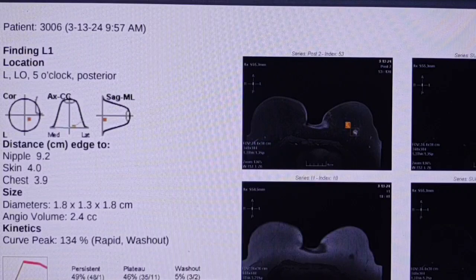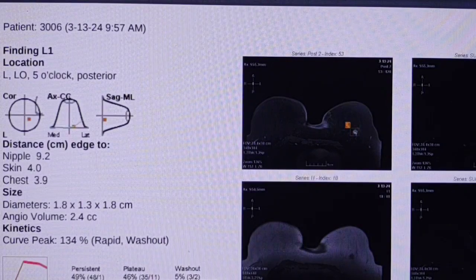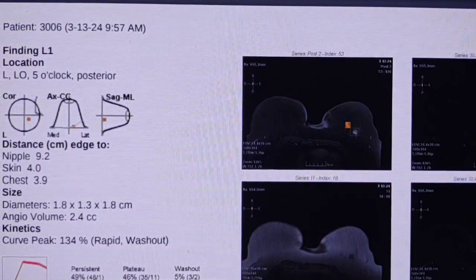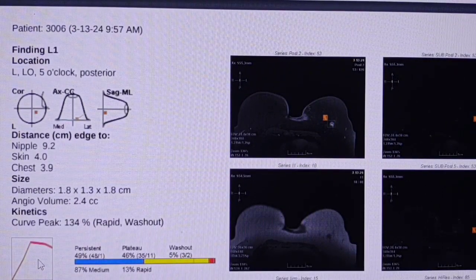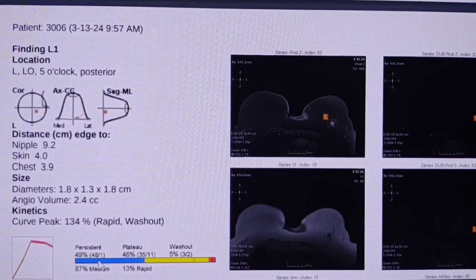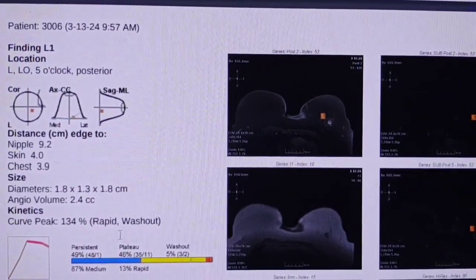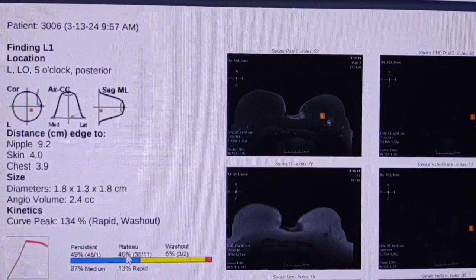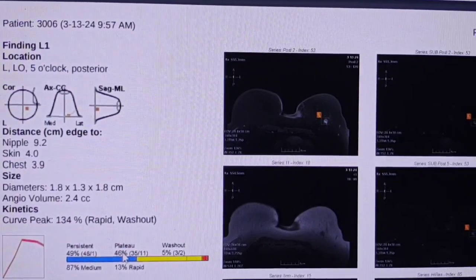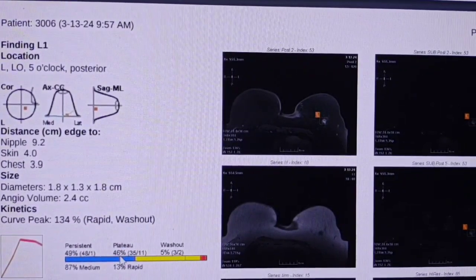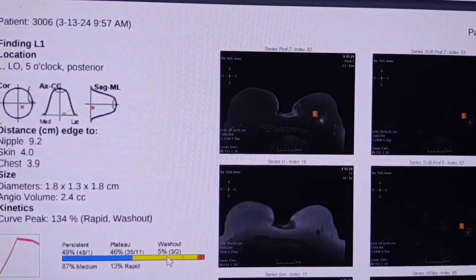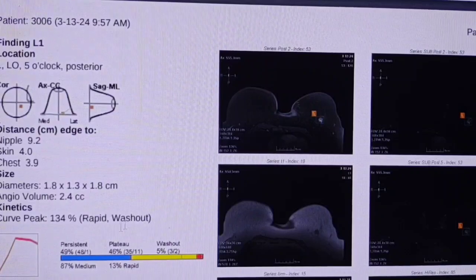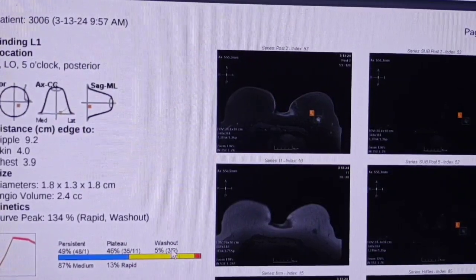As for the kinetics, we can see that there is rapid enhancement in the initial phase. There is plateau type 2 kinetics curves in 46% and rapid washout in 5%, so the overall appearance of the kinetics is suspicious.